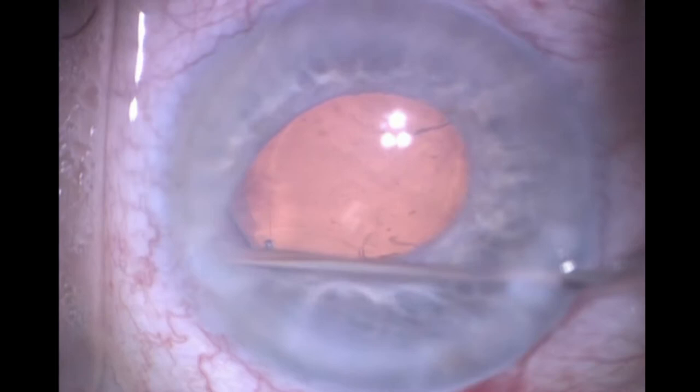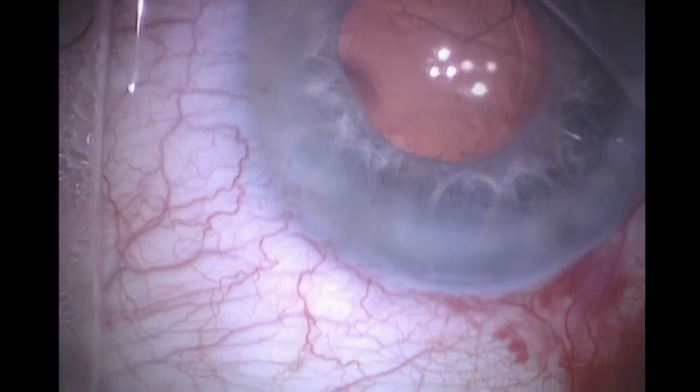The two haptics are outside of the bag, and this is the way I prefer to fixate using the capsular bag when there's diffuse zonulopathy. The patient did have glaucoma, so I placed a classic iStent — this is before the availability of the iStent inject or the Hydrus from Ivantis. The case is then done and the OVD is finally removed.